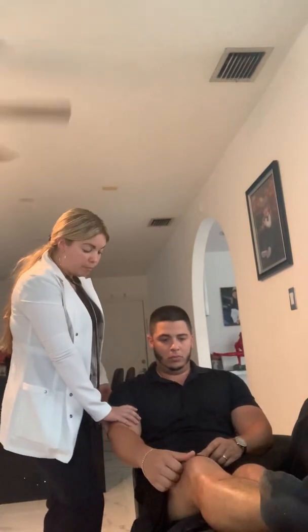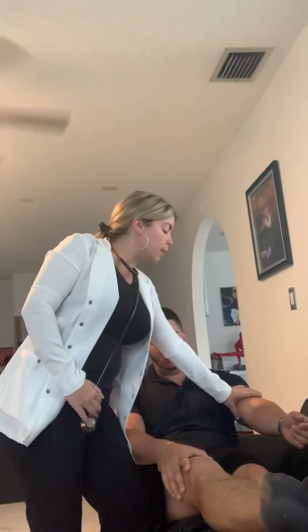To calculate the ankle brachial index, I'm gonna take the blood pressure of the right arm 2 times, and I'm gonna add the systolic values and then divide by 2. And I'm gonna do the same here. I'm gonna take the blood pressure 2 times on the left arm, and I'm gonna have the systolic values. I'm gonna add those numbers and divide by 2, and I'm gonna stay with the highest value. And then I'm gonna put it in the denominator of the equation.